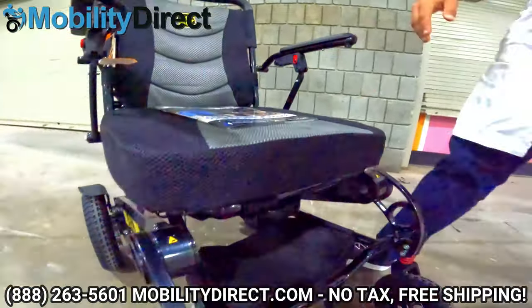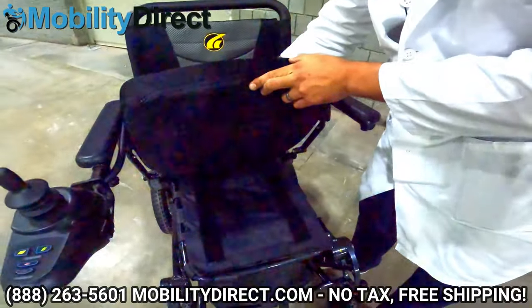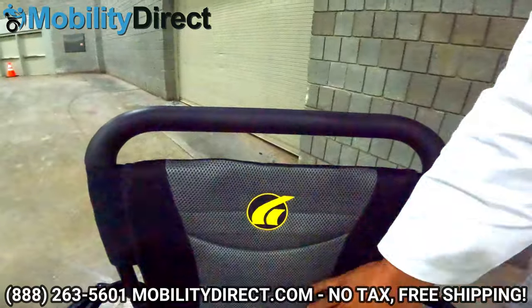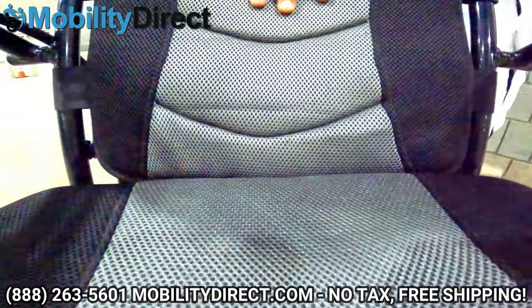The seat is very comfortable and removable, so you can put third-party seats on there as well. It's approximately 17 inches wide by 17 inches deep, and it has a padded back which is very comfortable.